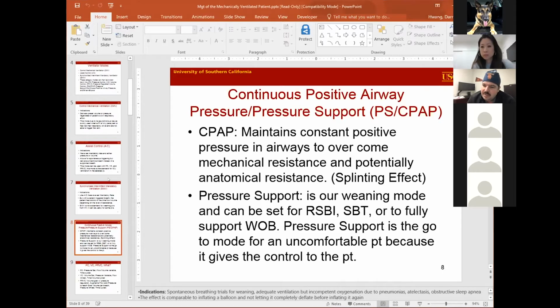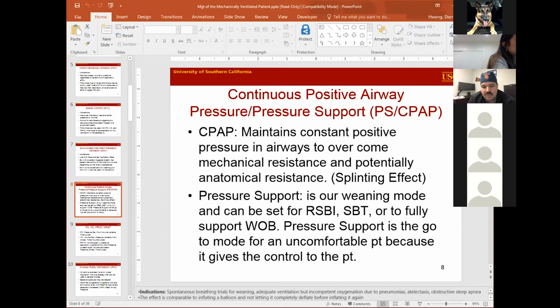One of the other key components of mechanical ventilation for these hypoxic patients with oxygenation needs is very tight control over the PEEP. PEEP is positive end expiratory pressure. This is a baseline pressure that we use to help keep the lung inflated at all times. It helps us reduce driving pressure. It also helps us increase mean airway pressure to treat patients with high means to again support oxygenation. Let's keep moving forward.